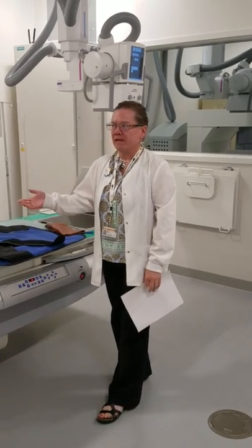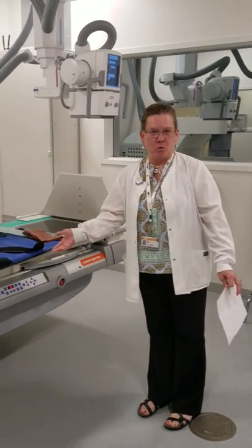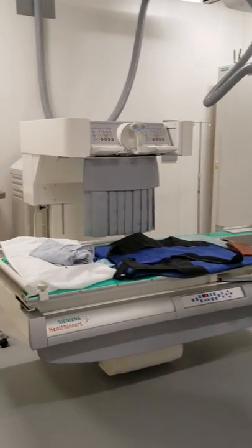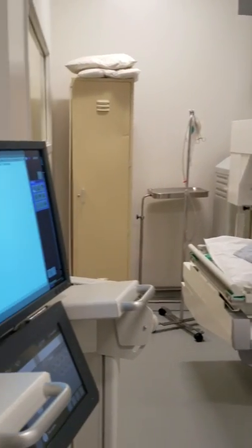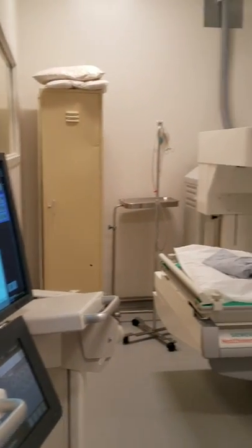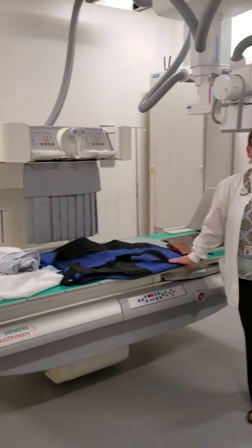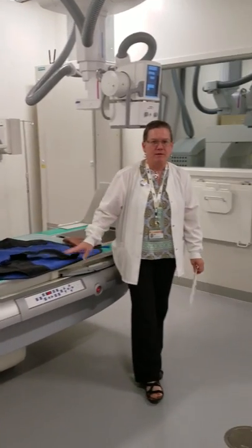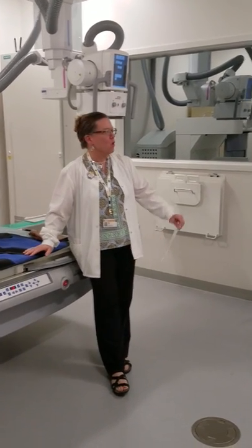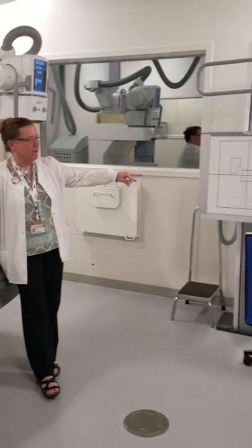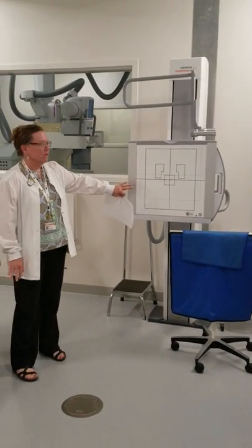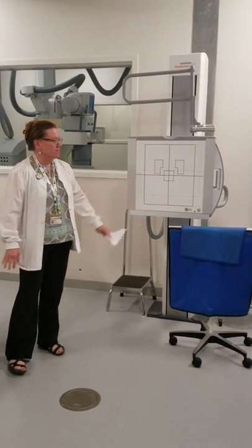We are standing in what we call an R&F room, or a routine and fluoroscopy room. We can do numerous procedures in here — a fluoroscopy exam, tabletop exams, table Bucky exams where the patient is laying on the table, or we can have our patient standing up at the chest board as an upright Bucky.